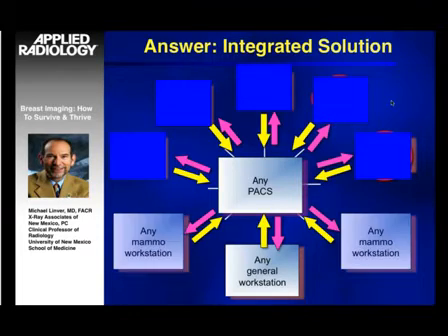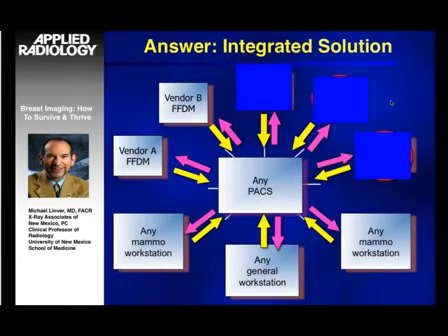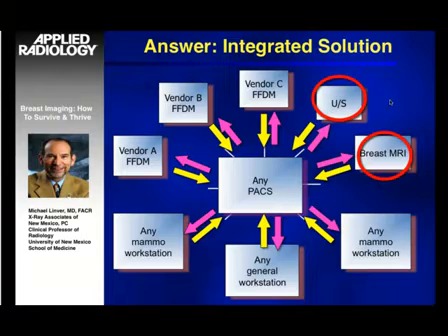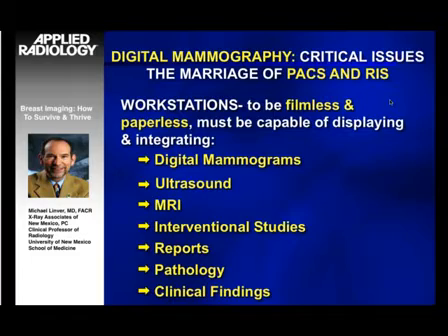Starting with the general workstation, which is fine to have a general workstation, but as you know, within the mammography system, you must have mammography workstations as well that are going to communicate with the PACS system. And as I mentioned, not only that, you've got to have good communication with a full field digital unit, whether it's one vendor or a different vendor, or yet a third vendor, all of which must be able to communicate with a well-organized PACS system. Not only that, you have to bring in other technologies so that these can be shared and integrated into the system, not just mammography, but also ultrasound, also breast MRI, also nuclear medicine, for instance. All of these issues, they all have to be available and integrated through a well-designed PACS system.